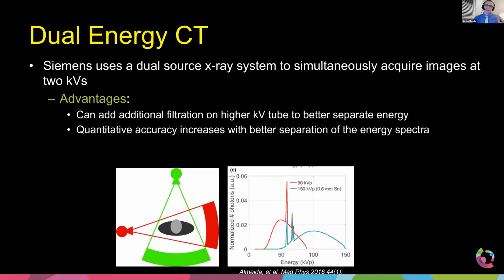And who does that matter the most to? The physicist and the technologist. They're the ones that have to get the right numbers in the right place. And when they do that, they present the images. You remember our optimization team. They present the images to the radiologist, and the radiologists say, oh, too noisy, not noisy enough, too much contrast. And then you work as a team to get the right image.